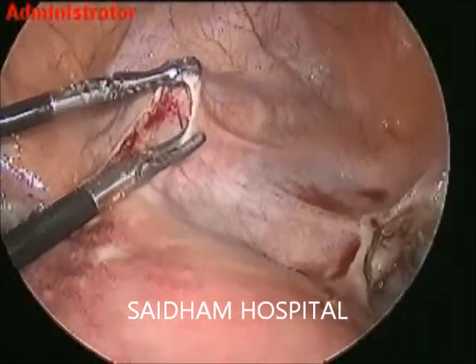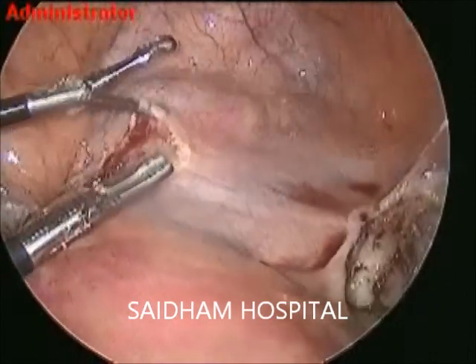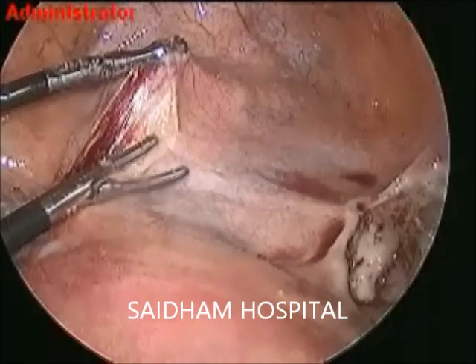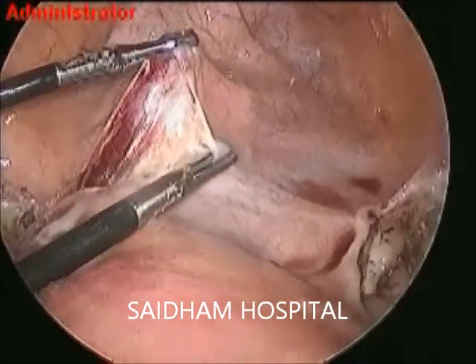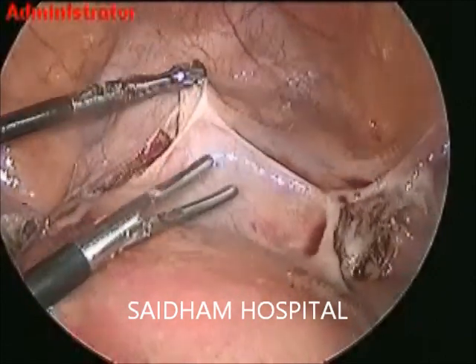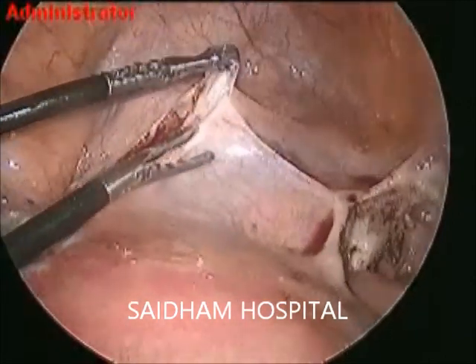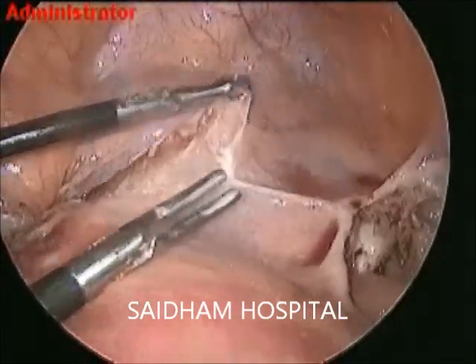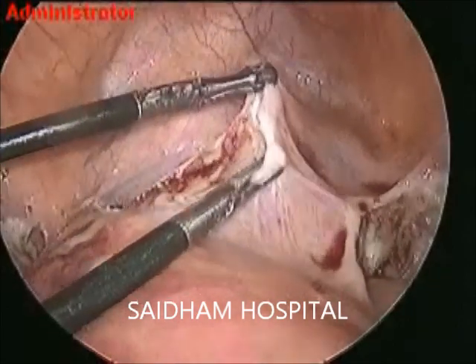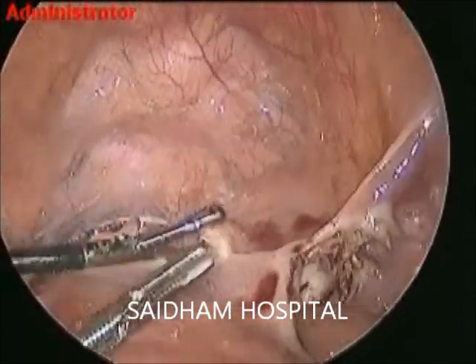Lift and cut only peritoneum by pure cutting mode. When there is excessive blood, tough fibrous tissue, endometriosis, or excessive coagulation, there is formation of excessive fog. Excessive fog formation will increase the operative time and also dim your vision. So excessive fogging should be avoided — that is very important for all of us.